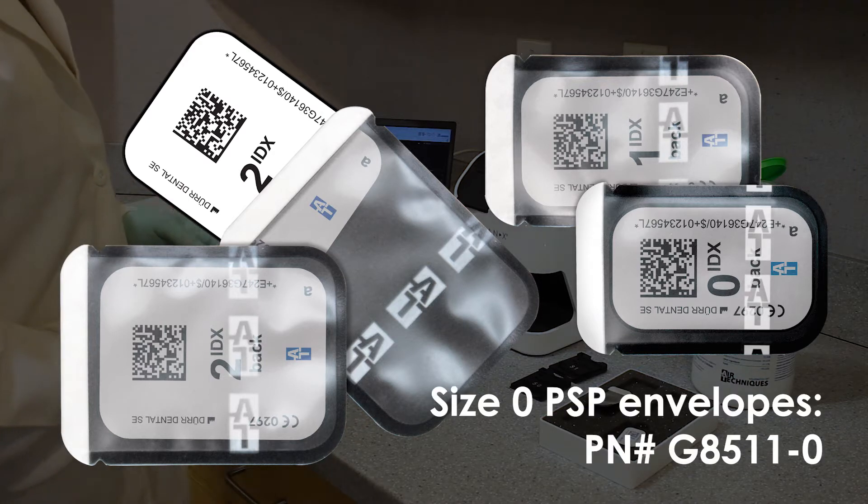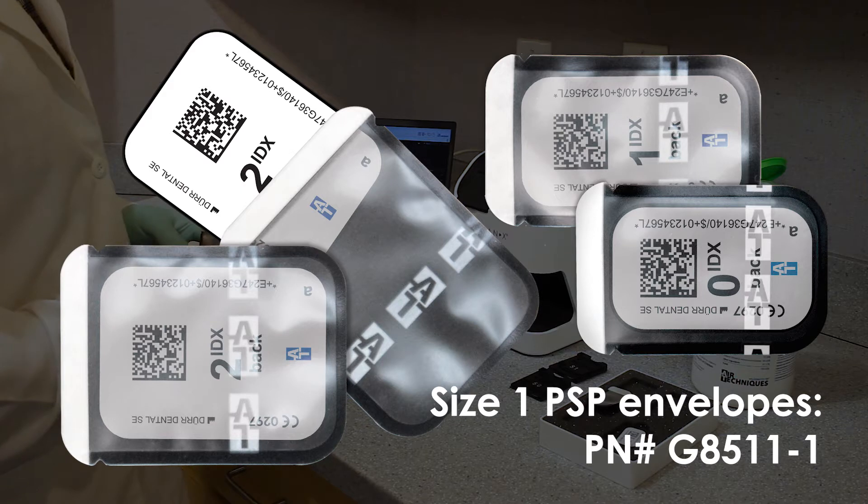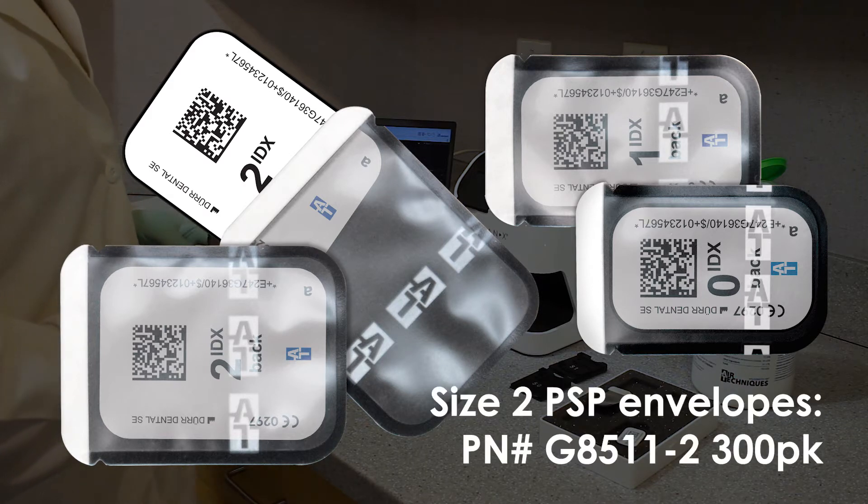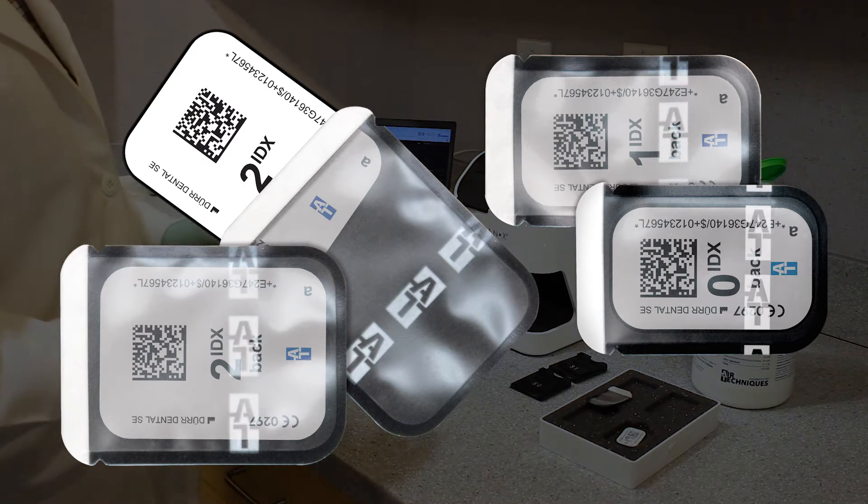The size 0 is going to be G8511-0. Size number 1 is G8511-1. And size number 2 is available in two separate part numbers. G8511-2 is the standard 300 pack, and G8511-2K would be the more economical 1,000 package of size 2 barrier envelopes.